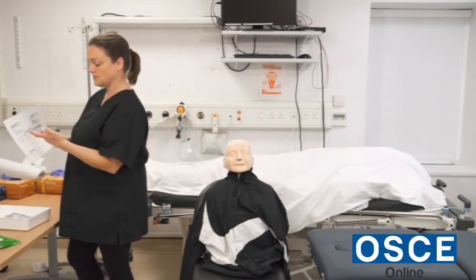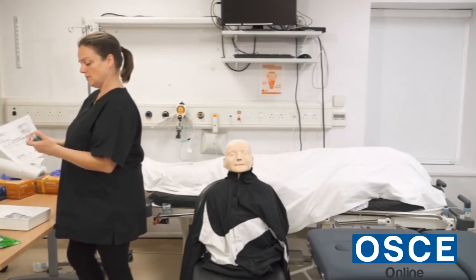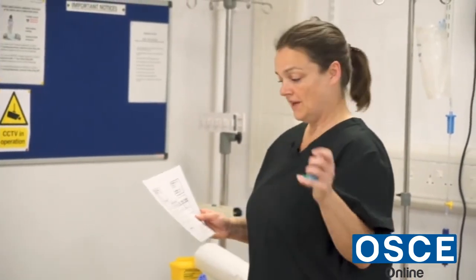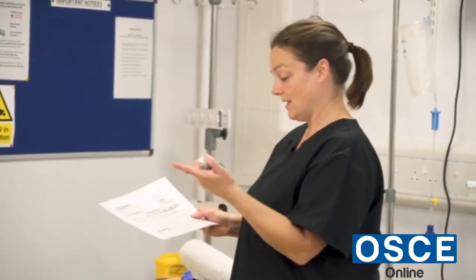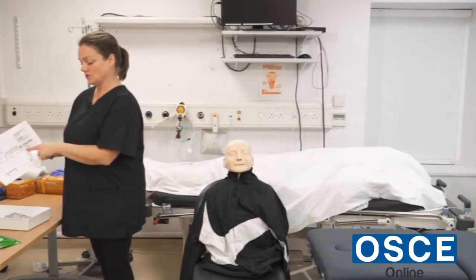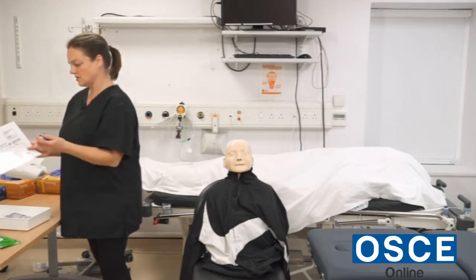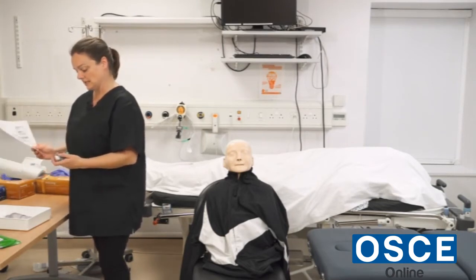200 micrograms, which the dosage here says it's salbutamol, and the dosage says 100 micrograms, which means every puff is 100 micrograms. So it's 2 puffs. The time is the right time, so it's 1400 hours. It's 4 times a day, and it says special instructions to use a spacer device, and it is signed by a doctor. So it also says he has no allergies. So I'm happy that this prescription is legal and correct.